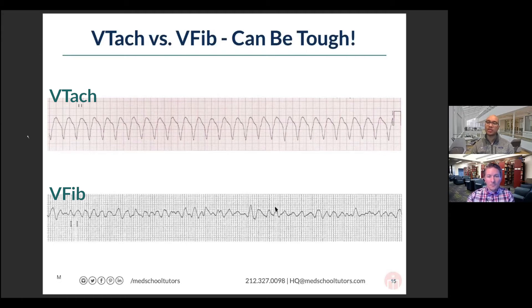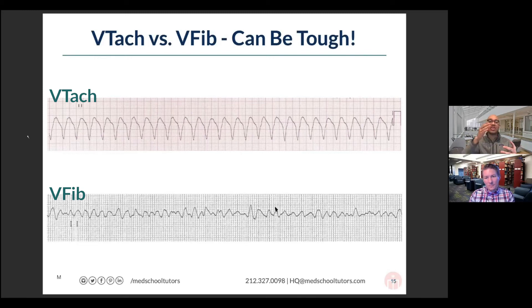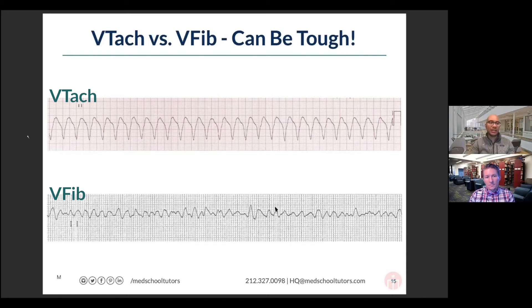One way to think about this is to correlate it with atrial rhythms. Ventricular fibrillation is like a blown-up version of the undulating bag-of-worms baseline seen in the atria with AFib. As mentioned, in flutter you see the sawtooth pattern — that same mental imagery applies but in the ventricles. This alludes to the underlying pathophysiology: quivering atria, quivering ventricles. In monomorphic VT, aberrant electrical activity whirls around a particular anatomic structure in the atria or around a scar in the ventricles, predisposing to VTac.